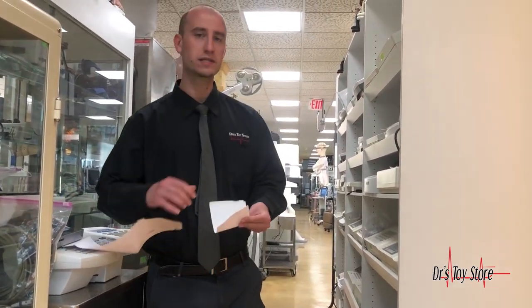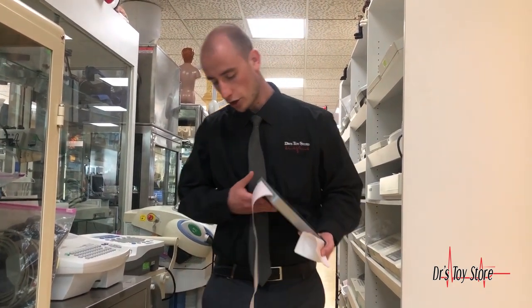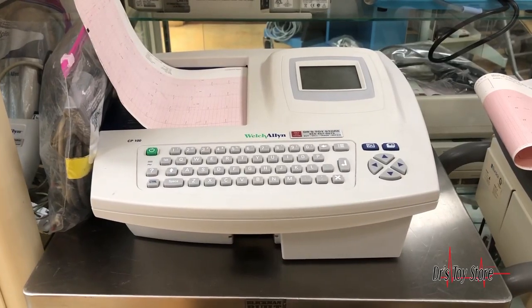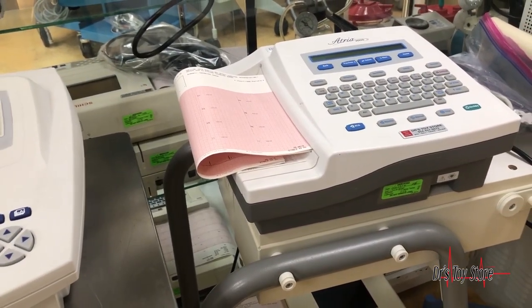Reimbursements and primary care physician revenue go down and down, so this is a great way to stay above the curve. This EKG is brand new with a three-year warranty — the Cardio FIT FT1. We have it at the Doctor's Toy Store for much less than everything else, and you get free training with it.